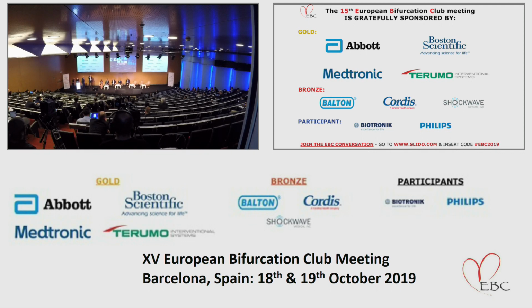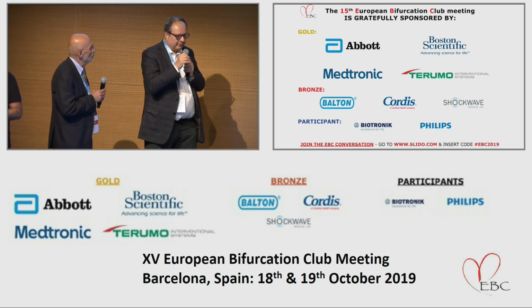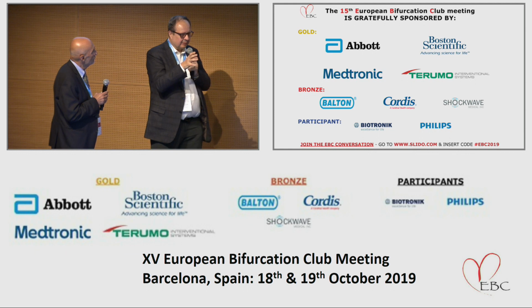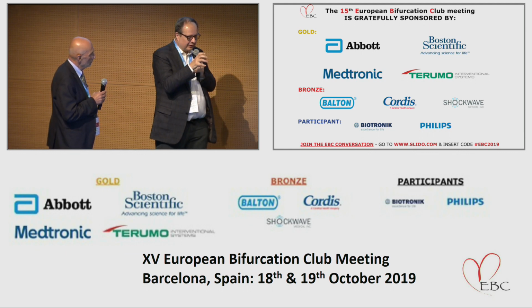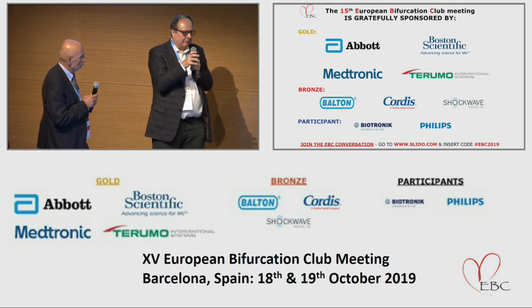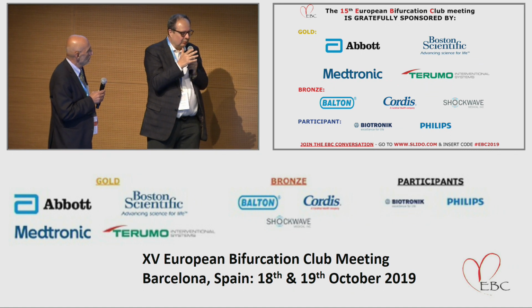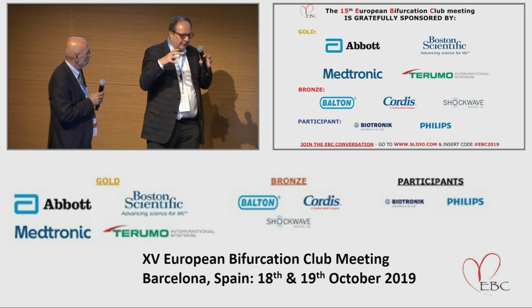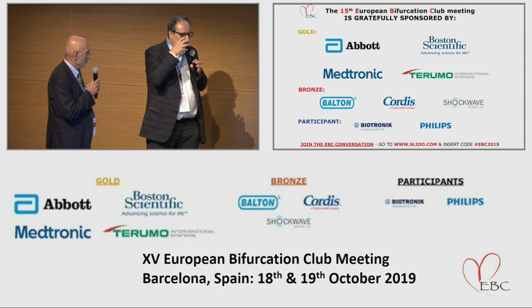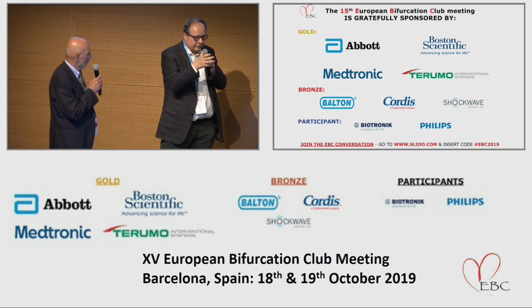And by the way, somebody said earlier that it's the kissing balloon inflation that optimizes the ostium. It's not the kissing balloon inflation. It's the recrossing and the high pressure inflation that you do in the ostium before you do the kiss. The kissing balloon should never be a high pressure inflation. And whether it is or not, a kissing balloon will never give you the best opening in the side branch ostium. It's the inflation that you do before that kissing balloon inflation in the side branch through those struts initially.